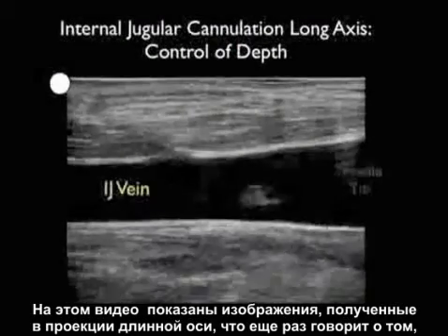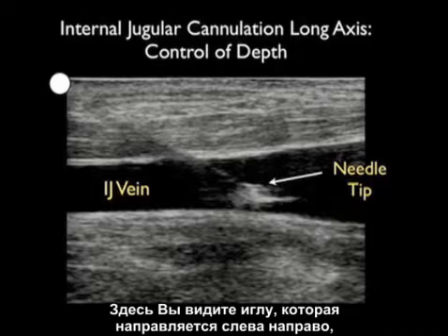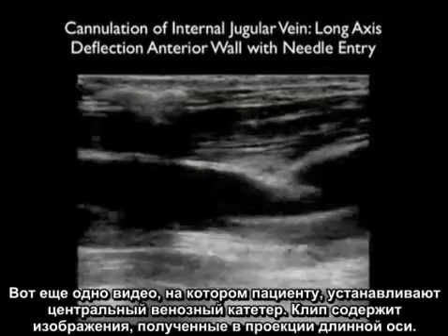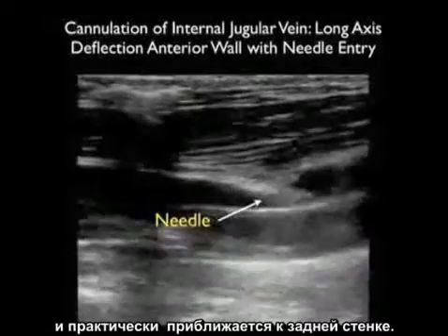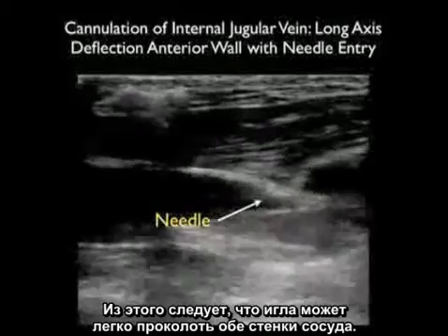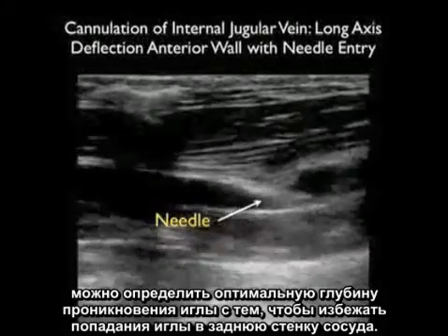Here's a video clip in the long axis configuration emphasizing that the long axis view is great for determining needle depth. We see a needle coming in from left to right, and we can visualize the needle tip smack within the vessel lumen. In another long axis clip, the needle tip deflects the anterior wall of the vessel, pushing it down so that it almost meets the posterior wall — meaning the needle could easily pass through both walls of the vessel. Using the long axis technique, one can best adjust the needle tip depth and avoid puncturing the back wall of the vessel.